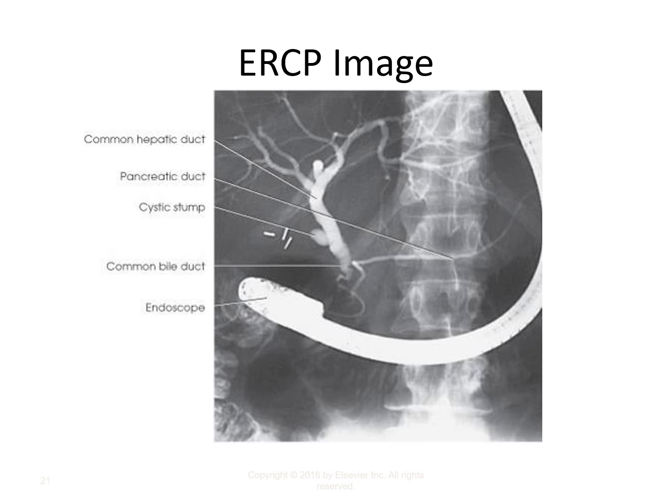Sphincterotomy just cuts a hole in the side of the ampulla and allows for a wider opening into the small bowel. With a balloon, what you do is you put a catheter with a balloon attached to it and advance it all the way up into the hepatic duct, and then inflate the balloon at the union of the hepatic ducts, and then just drag the inflated balloon down the common bile duct, kind of like a snowplow, and pull all the contents of the bile duct out into the small bowel.